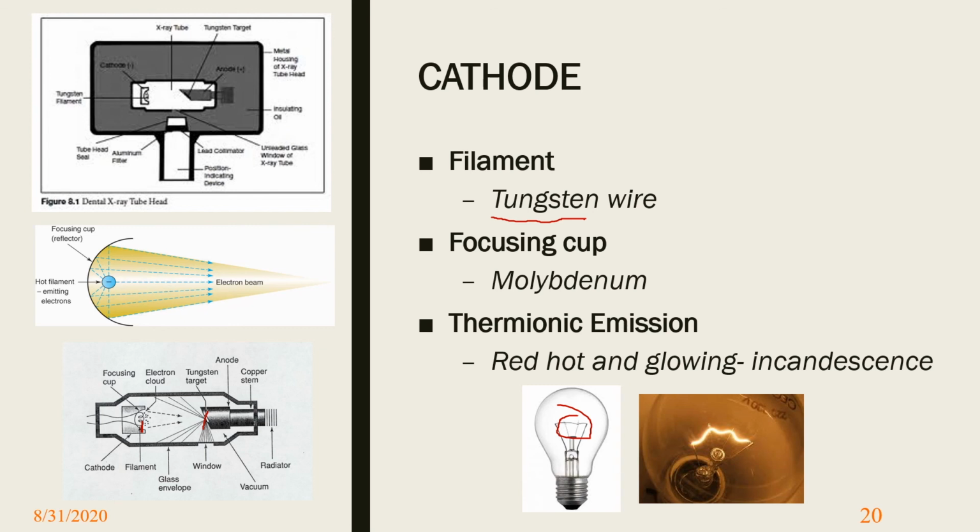On the cathode, we will also find a focusing cup. This focusing cup is made up of molybdenum, and you should know that as well.